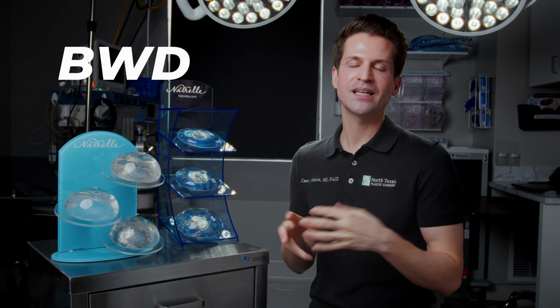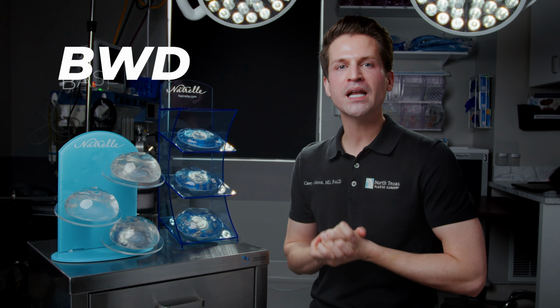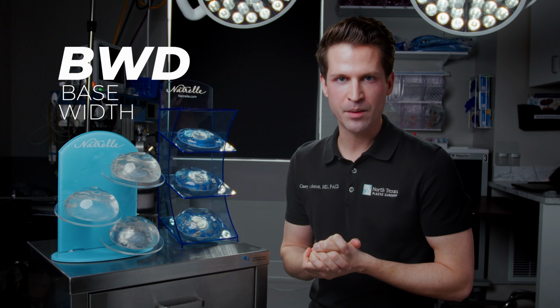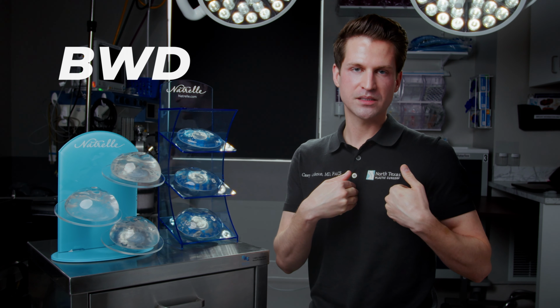One of the things patients love to find on the internet, and they'll come to me asking, is what's my BWD? They have no idea what it means, but they know they're supposed to ask about it, which is good. That is your base width diameter. In the simplest terms, how wide is my breast? Now, that's the simplest way to describe it. The problem is that it is a subjective measurement.